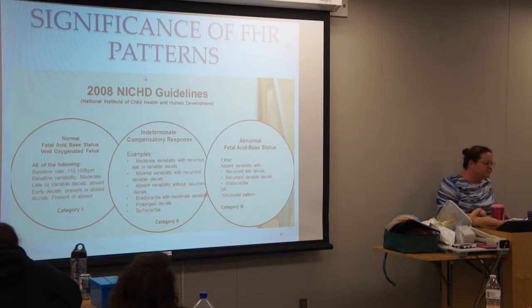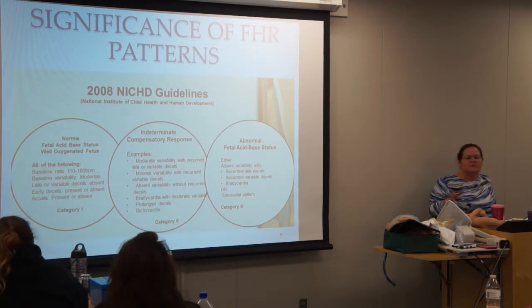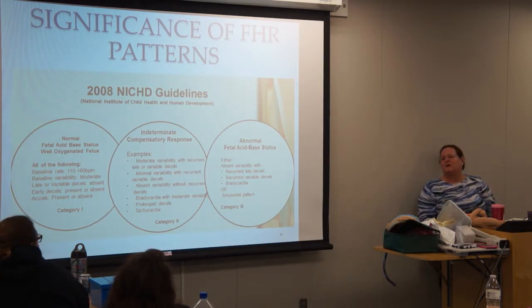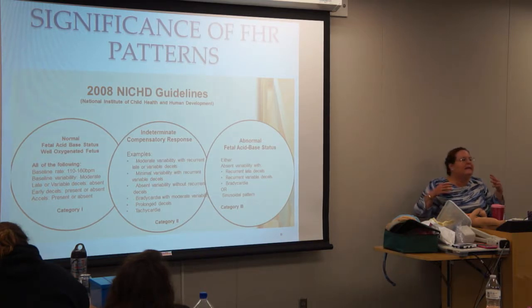So in 2008, the National Institute of Child Health and Human Development said, you know what? There's so many cases when the nurse in labor and delivery sees something and tells the doctor, oh, everything looks pretty good, or, you know, I'm just not liking what I'm seeing on this baby. My strip looks crappy. My strip is giving me a little bit of a headache. Like, I'm thinking I want to check out and go home early. This strip is bothering me so much. Well, that doesn't tell the healthcare provider any information that they can use to make an intelligent decision.